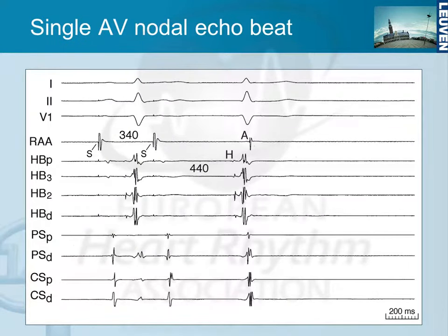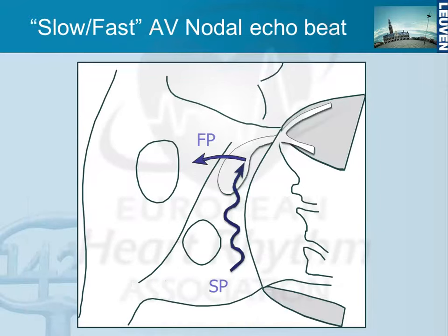Sometimes during conduction over the slow pathway — here with an AH interval of 440 milliseconds — you also see some atrial activity occurring at the end, which is what we call an AV nodal echo beat. We have conduction over the slow pathway, but we do not only conduct to the ventricles over the HIS bundle — we also conduct back to the atrium over the fast pathway. This depends on the delay over the slow pathway, because the fast pathway, which was blocked antegradely, has to recover from that earlier activation so that it is able to conduct retrogradely. The atrium also has to recover from the previous beat and be excitable again — only then you will see this echo beat.